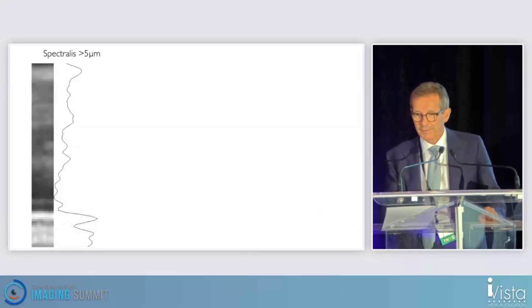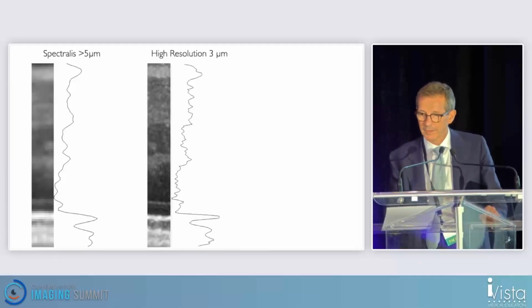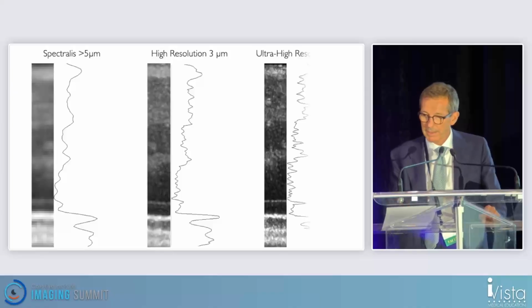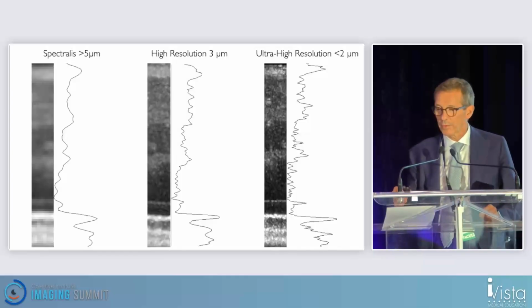Again, these are the lines that you can get from 5 microns resolution, from 3 microns, and again from 2 microns. You see even more lines.